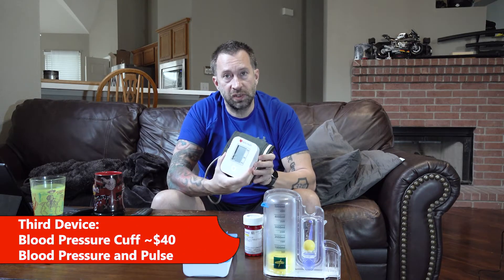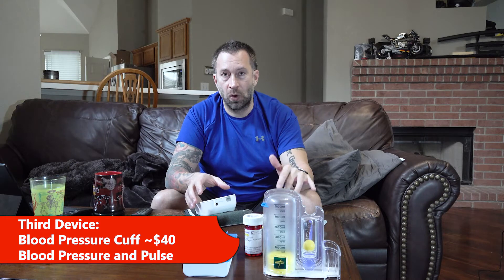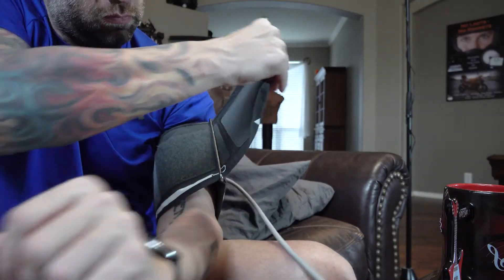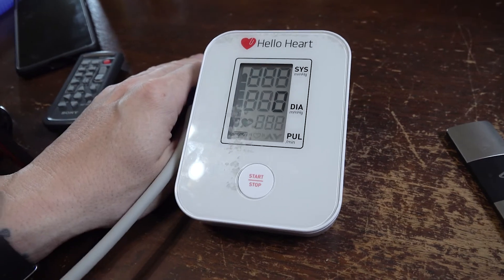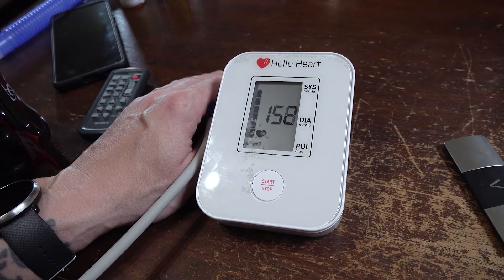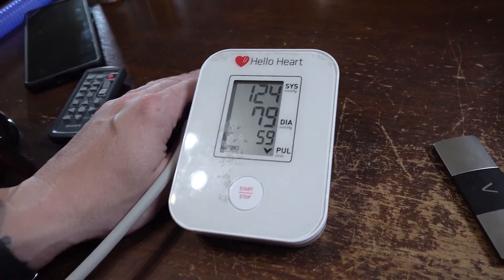The next tool is very common — most of us have seen it before: a blood pressure cuff. There are a lot of different styles; this particular one connects to a phone app and documents data there, though you don't necessarily need one that does that. The biggest thing to know when putting it on is to look for the arrow and make sure it's pointing right down the center line into the ditch of your arm. Put it on, make sure it's tight, sit very calmly, start the device, and it will apply pressure and trickle off. When finished, the display will tell you your blood pressure as well as your pulse rate.